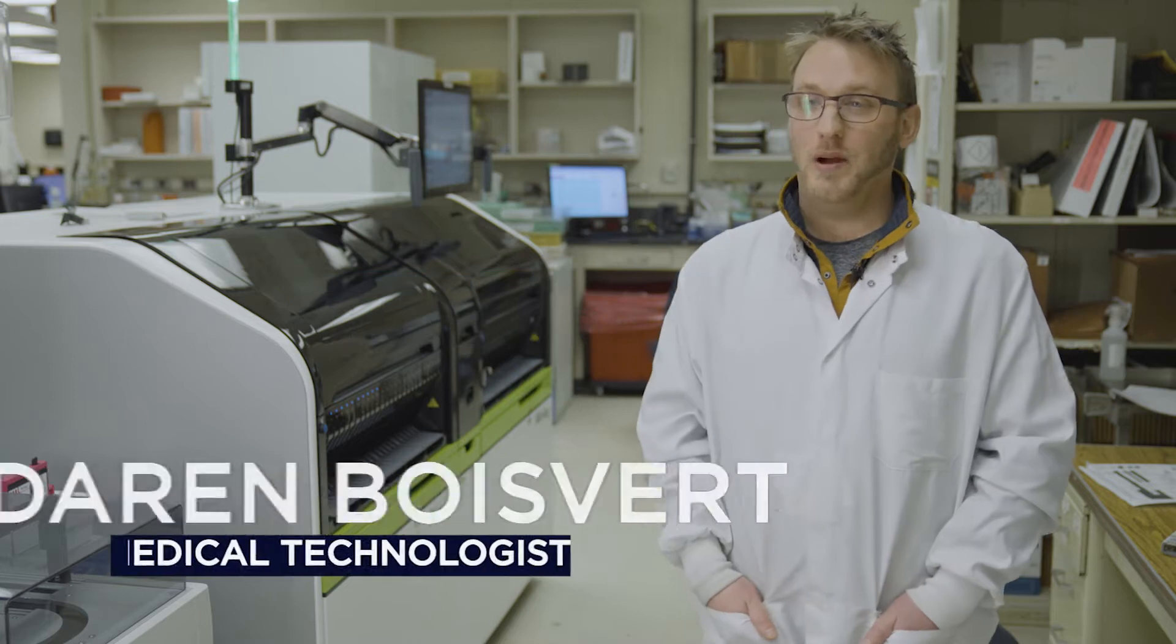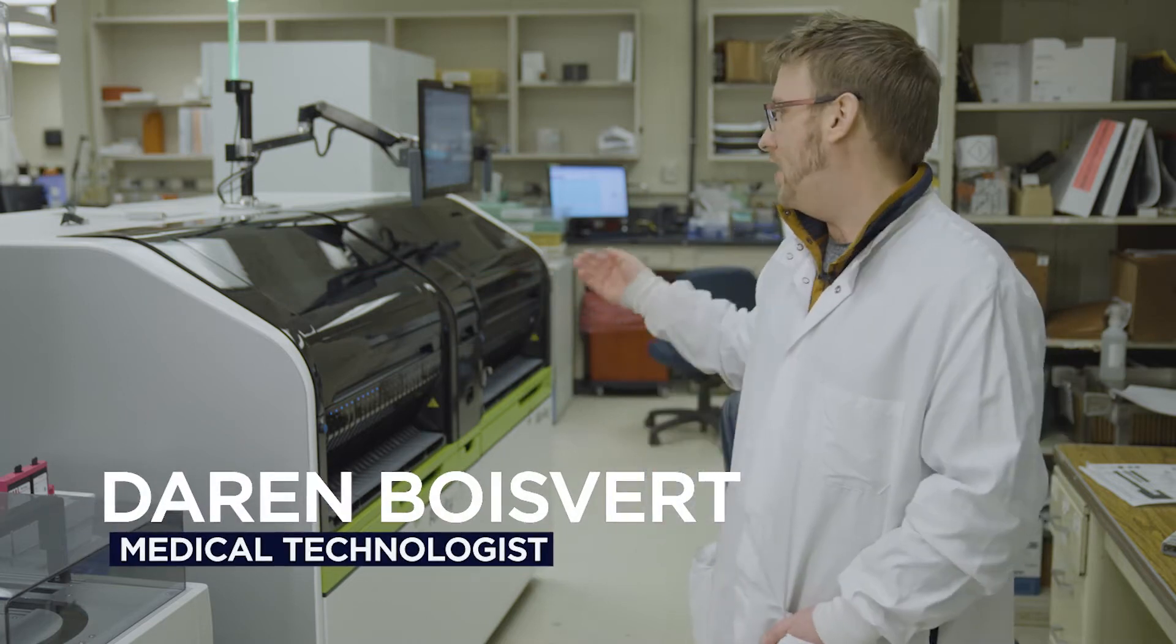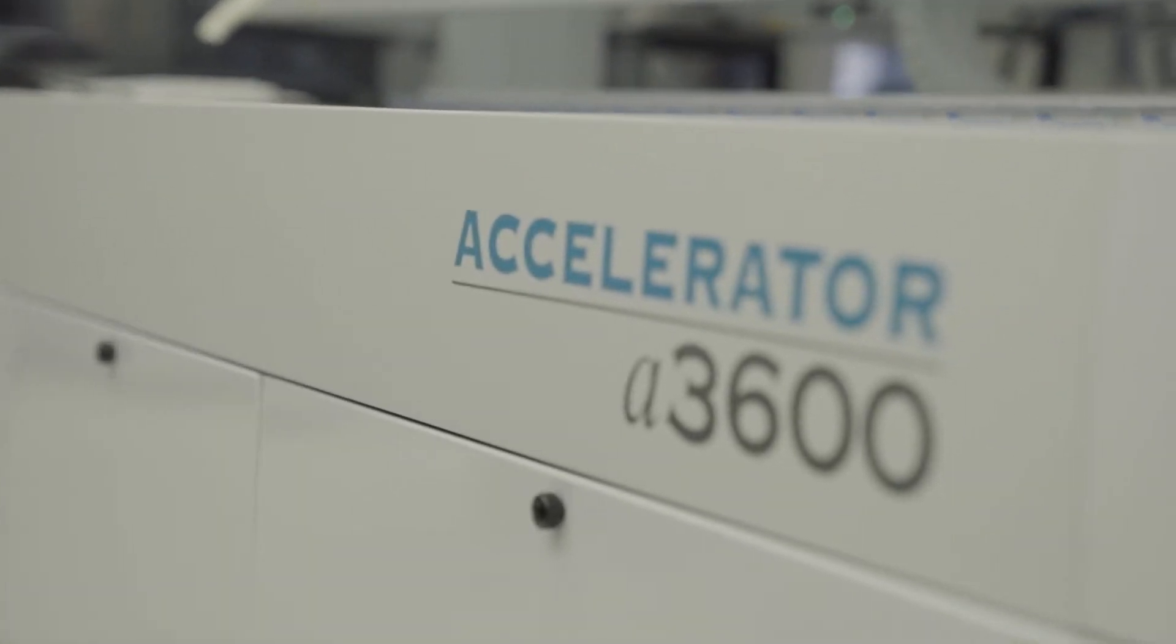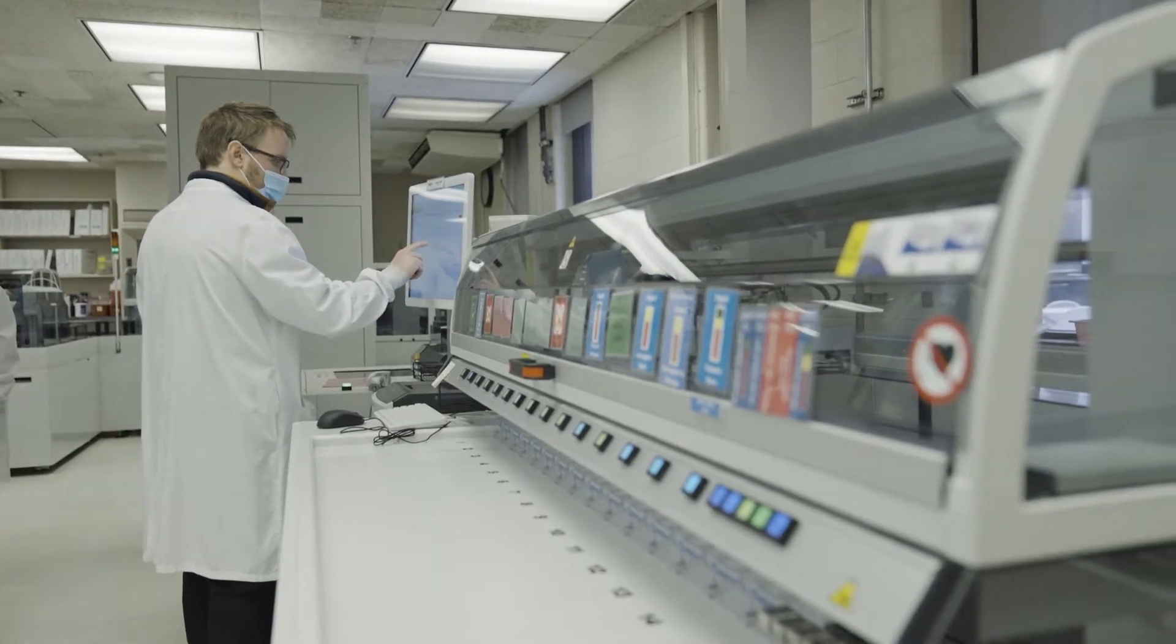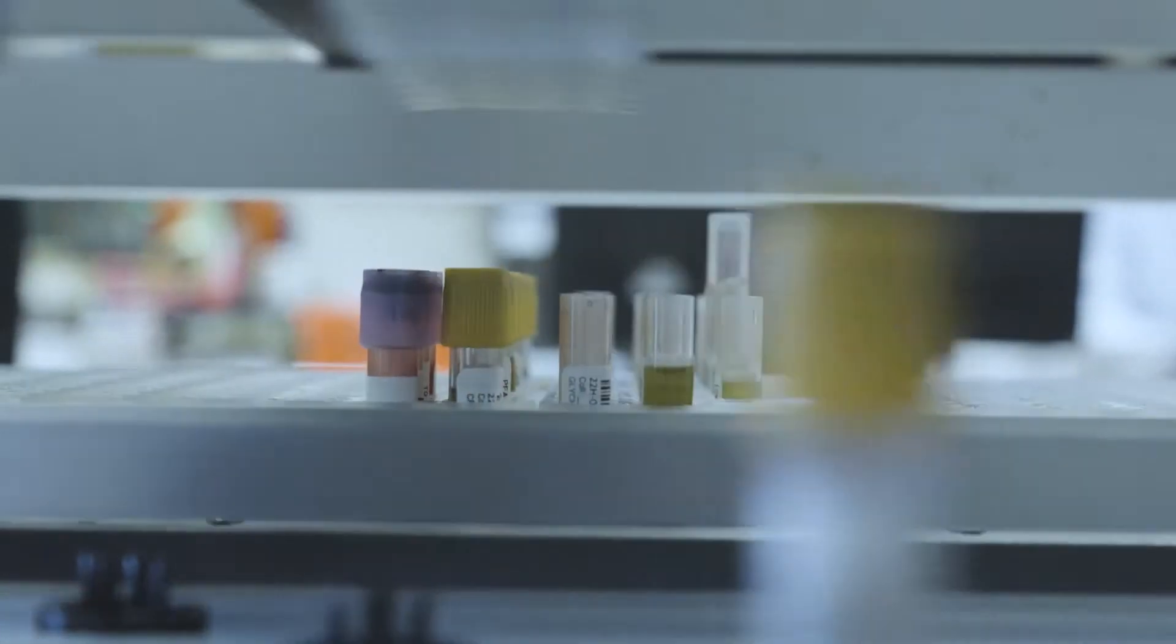This is the Department of Laboratory Medicine and this is our new accelerator track laboratory system. It is an automated track system that can receive, process, and deal with all our laboratory specimens.